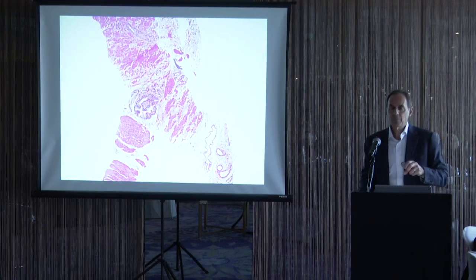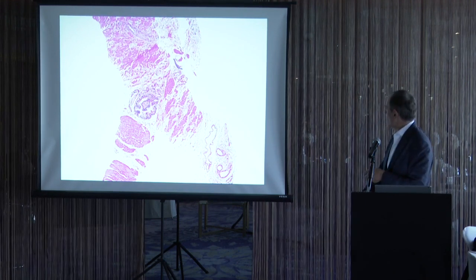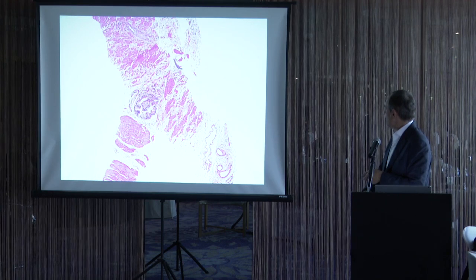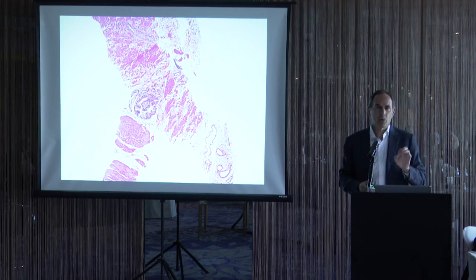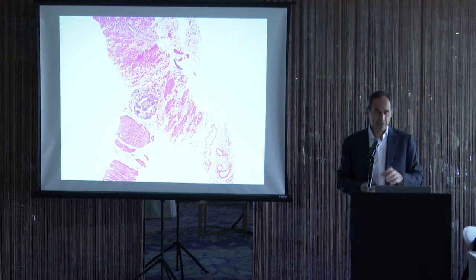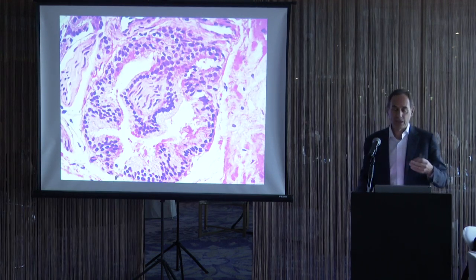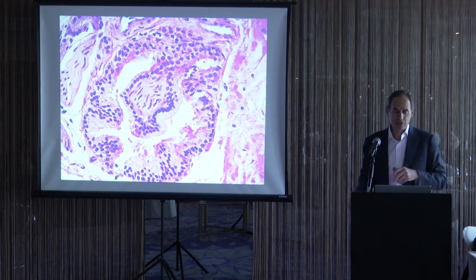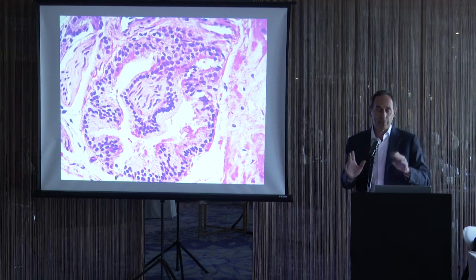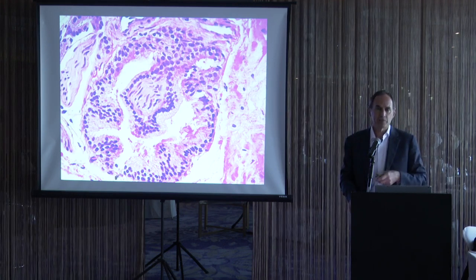So sometimes you're looking at a prostate needle biopsy, and you'll see a gland that at low power looks maybe benign, it has some infolding, but it's off all by itself, and you see a little pink thing in the middle. When you see that, you want to go down and look at it at higher magnification, because there's an entity which I described called pseudohyperplastic perineural invasion, where the glands look almost like a benign gland, but they're wrapping around a nerve. That is diagnostic of prostate cancer.